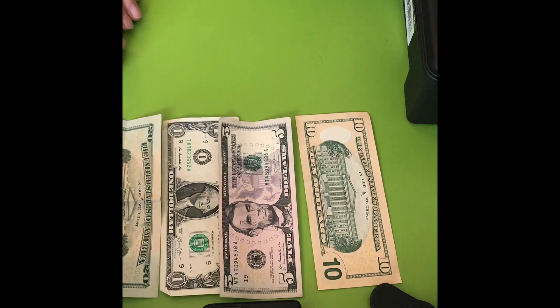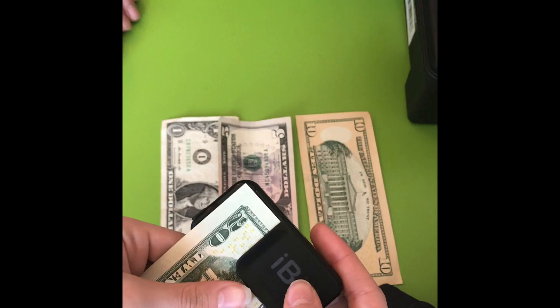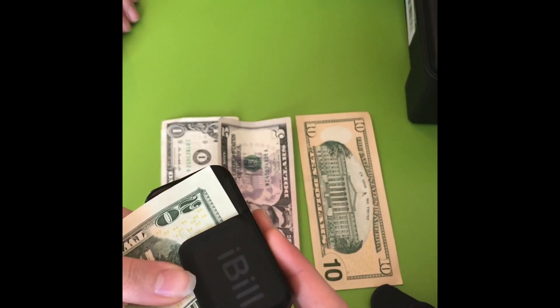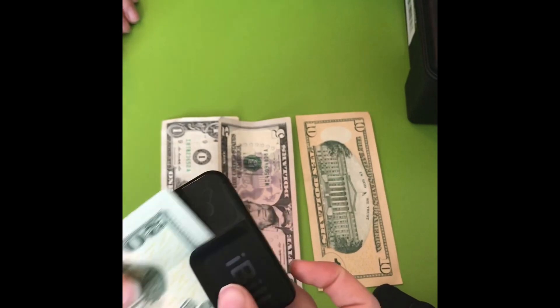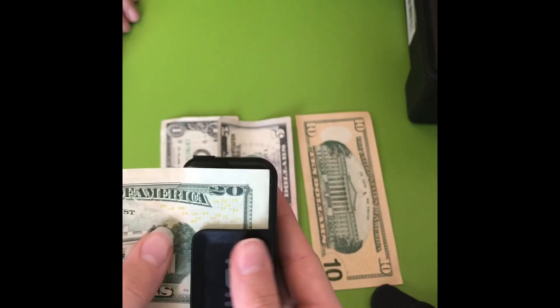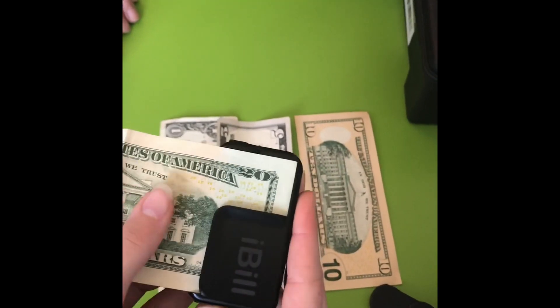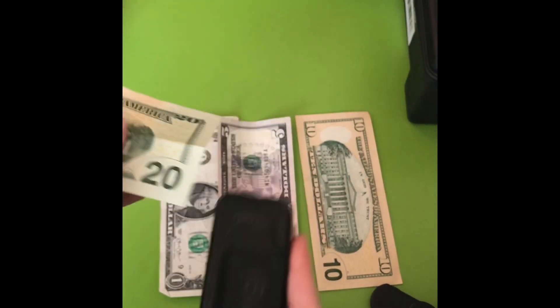So let's start with the first bill and check it with the iBill recognizer. Sometimes it gives you an error when it's not put in with the right orientation, and that just happens. Let's try again. There we go — that's a $20.